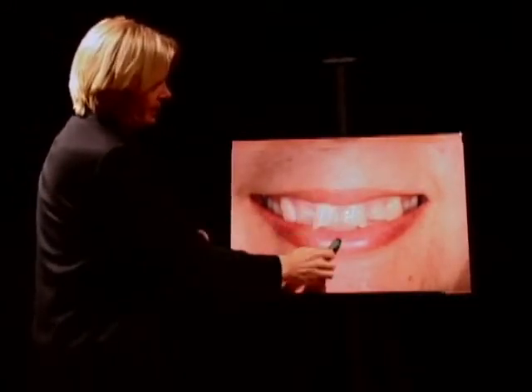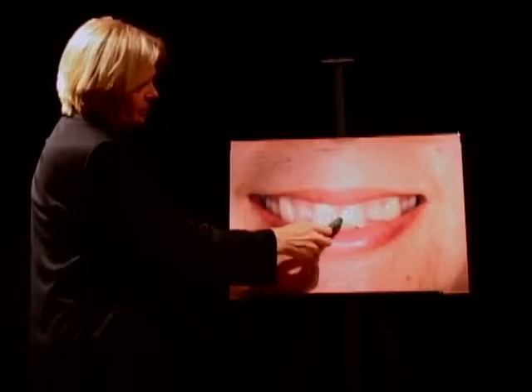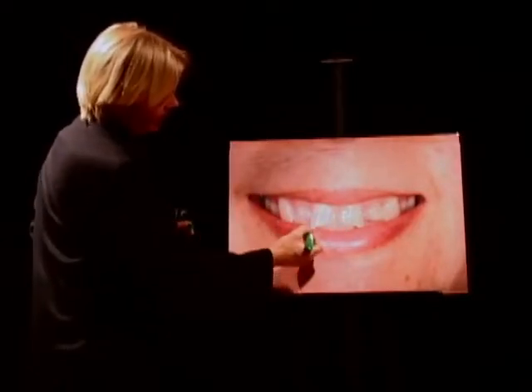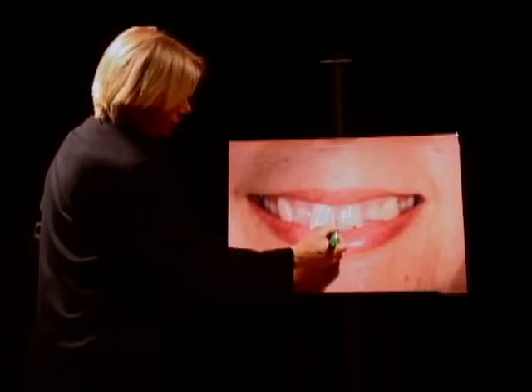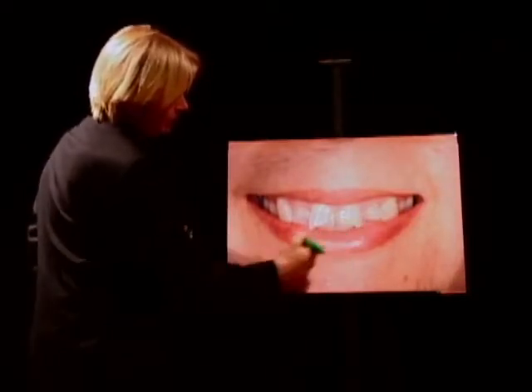She had a slight collapsed bite distance here, or like vertical distance between the base of the upper jaw and the base of the lower jaw, which could be utilized to actually recreate the space that was missing here and rebuild new restorations with the proper relationship. If I just had rebuilt the restorations up to here without actually raising the vertical relationship, the teeth would have been sitting on the lower lip, so that wouldn't have been a solution.